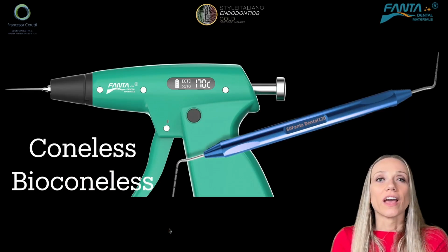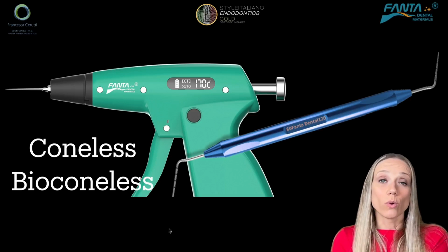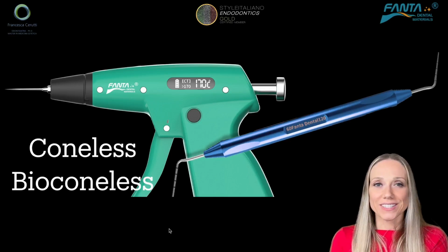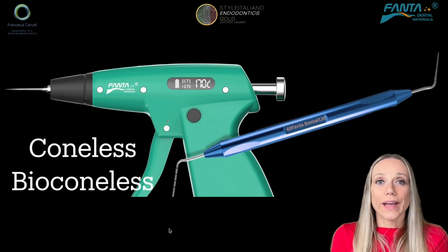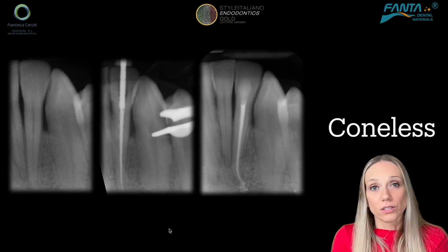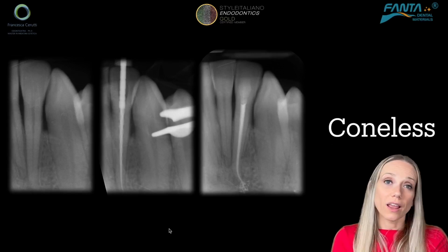And what if I don't have the e-heater? I just have the e-filler and a plugger. Well, I can still obturate with a warm technique by using the coneless or bioconeless technique. What's the difference between coneless and bioconeless? That in the coneless technique I use a conventional sealer, while in the bioconeless technique I use a calcium silicate based sealer. And this is an example of a tooth treated with the coneless technique, so just by extruding the warm gutta percha into the root canal and then packing it.